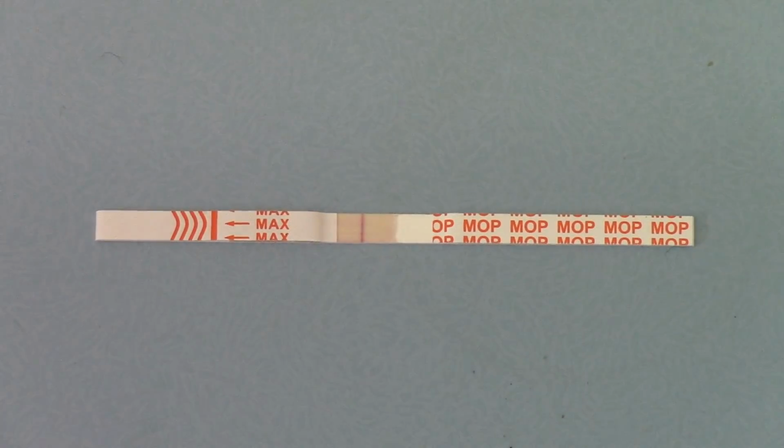Okay, so here we have the opiate test strip running. This is being dipped into a negative urine control solution, and you'll see in the central portion of this test strip the dye moving up towards the handle end, which is coded in this instance with MOP.